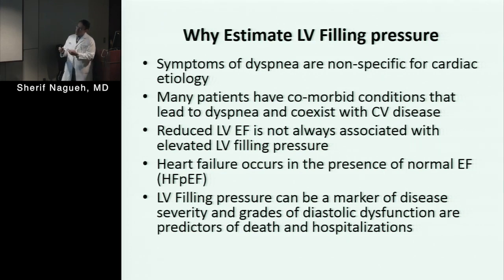Next comes a couple of points I want to make. Many clinicians, perhaps not necessarily cardiologists, but more like internists, once they know that the ejection fraction is depressed, that's all they want to get from the echocardiogram. You have all seen patients, maybe treated patients, who come in with a depressed ejection fraction, have problems, but they are not really in clinical failure with elevated LV filling pressures.